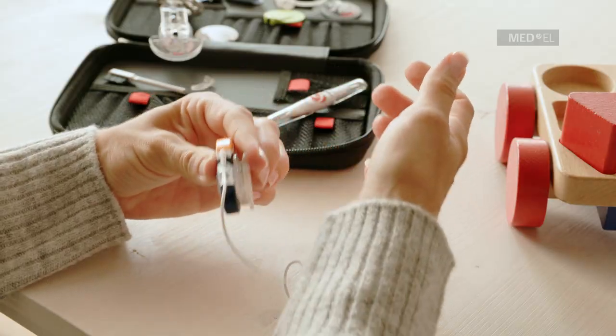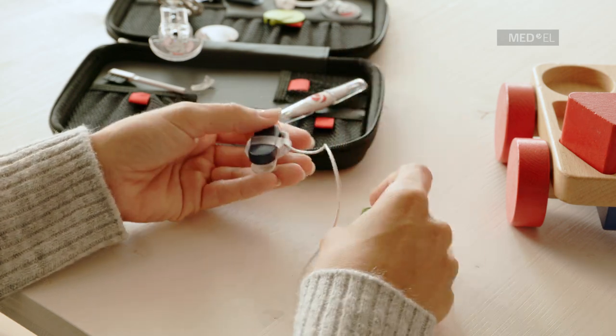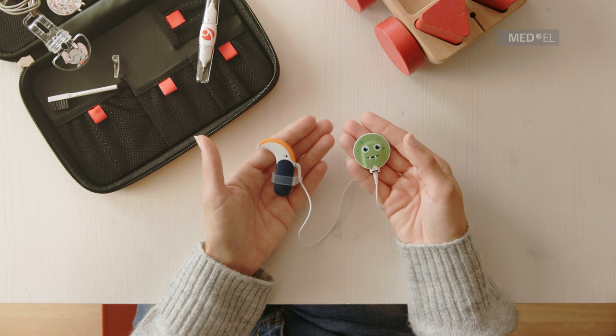Sonnet 2 can now be clipped to clothing. This wearing option can also be used for sporting activities which require a helmet.